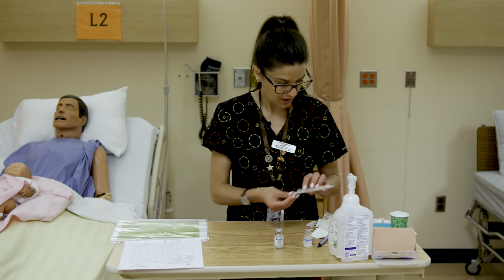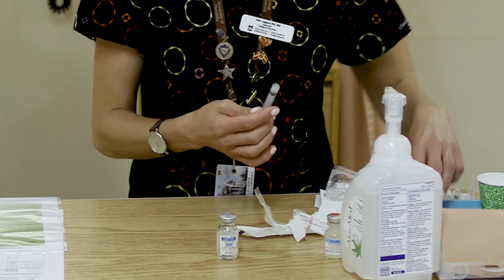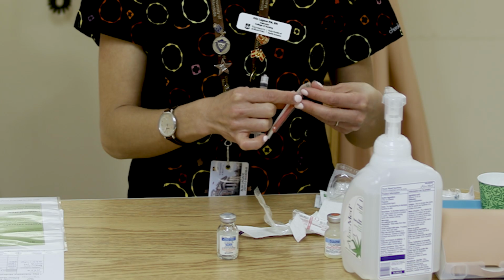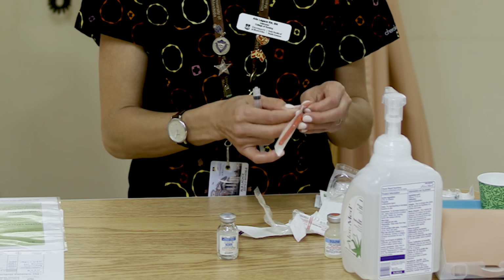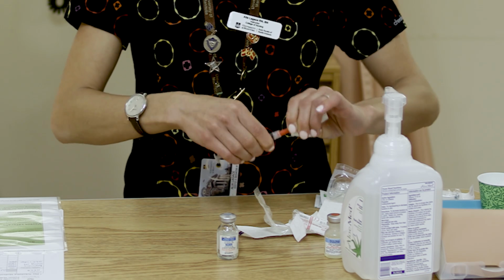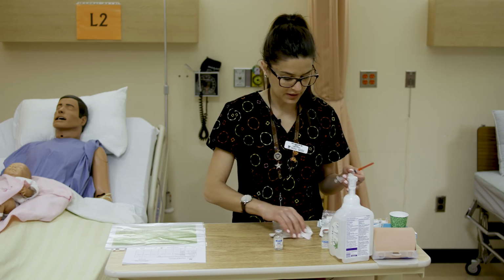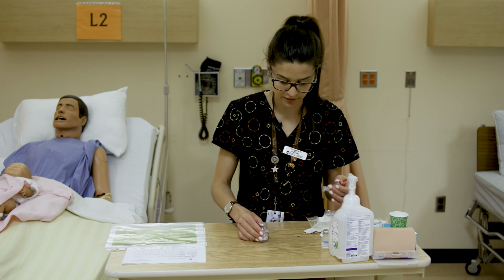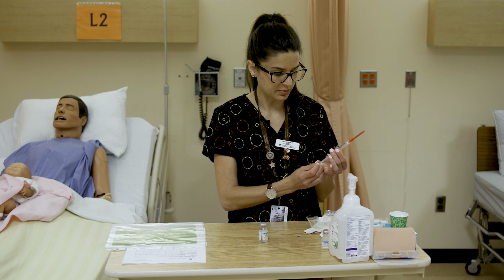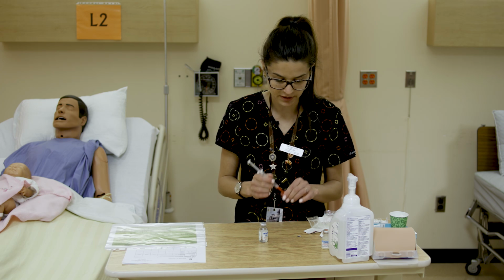So I'm going to use the 3 ml, so we'll open that up again and we'll get a new blunt fill. Peel it back and attach it. And so we've calculated that we need 2 mLs to get our 500 milligrams that is due. So we're going to pull back on the plunger again, unstick it there a little bit and put it at 2 because we're going to instill air.